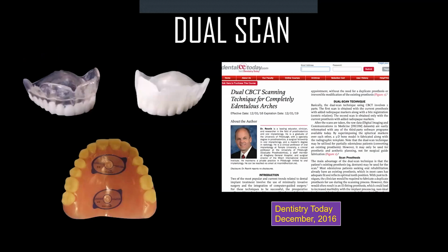So we do something that's called a dual scan technique here. My father wrote an article almost 10 years ago now in Dentistry Today that you can just type in on Google, and it walks through the step-by-step, but we'll also kind of go through it here. And what we do is we take a dual scan of the patient for it. So when we're looking at that 3D view in the CBCT planning software, we're able to see where that patient's denture tooth is and work backwards. We call that top-down treatment planning, where we figure out where the tooth needs to be, and then we work backwards to where that implant needs to be here.